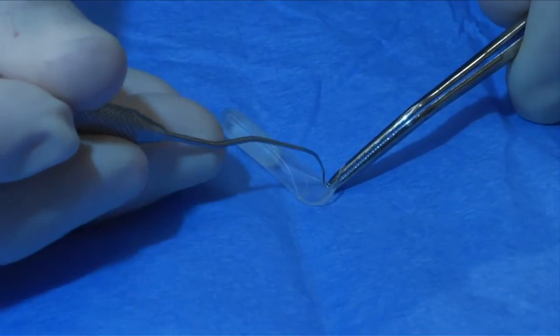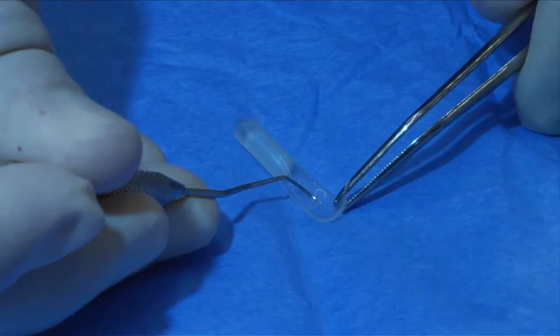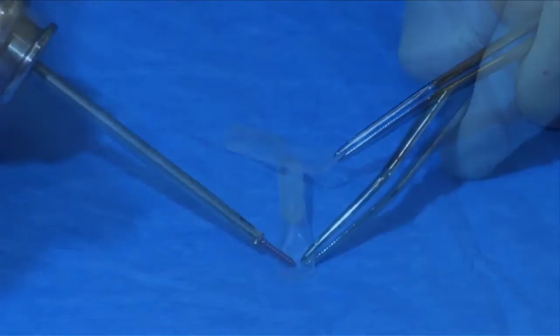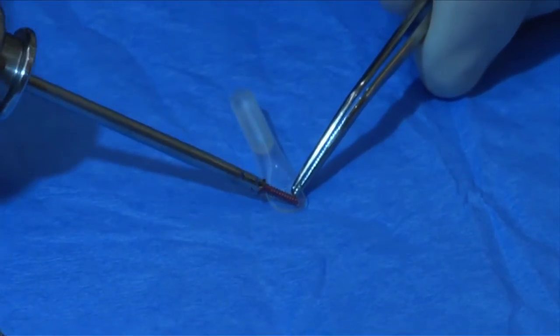The expander is fixed with a bone fixation screw, and that's why we perforate the expander's strap here. And a bone fixation screw is put into the hole.